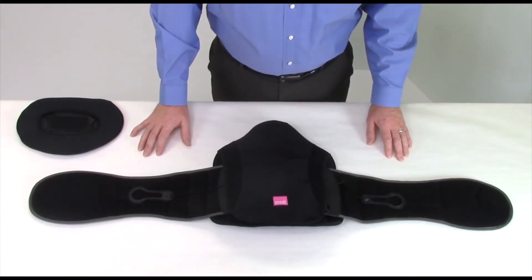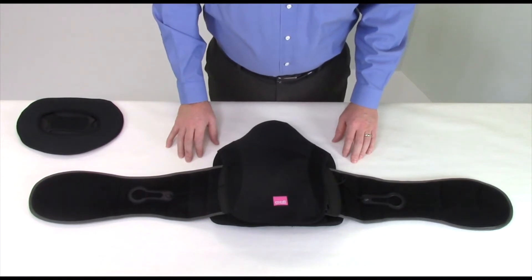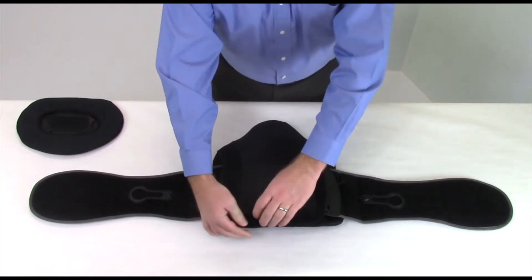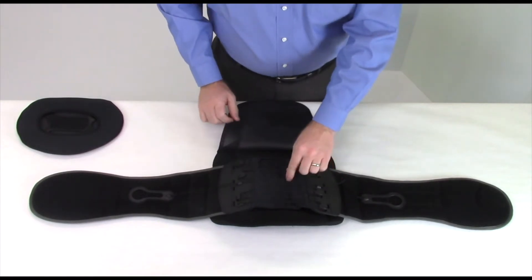The first step in fitting the device is adjusting the size. To make this adjustment, lay the brace on a flat surface, front side down, so the medi logo is facing you. Open the back cover by pulling it away from the Velcro closure at the bottom. This will expose the pulley cord frames and the pulley cords.